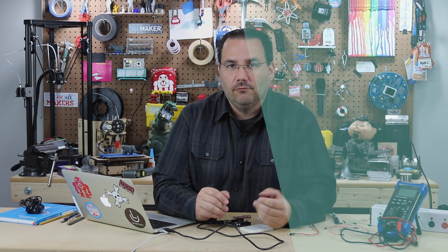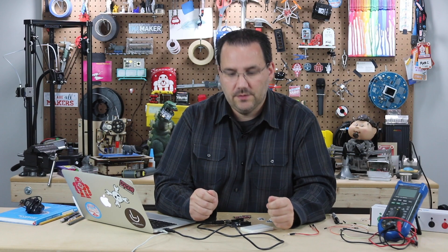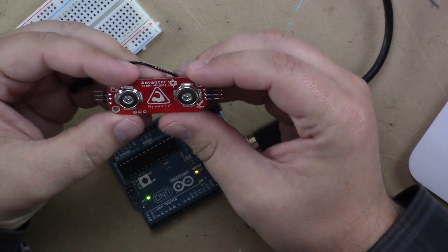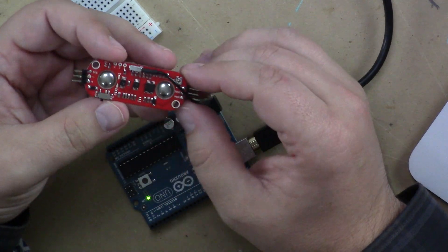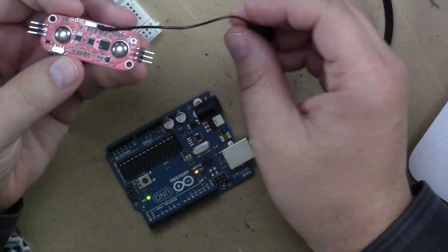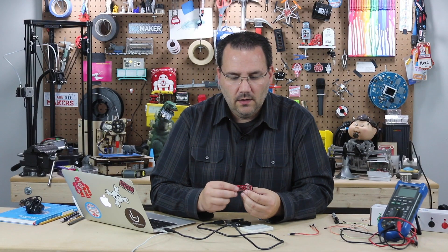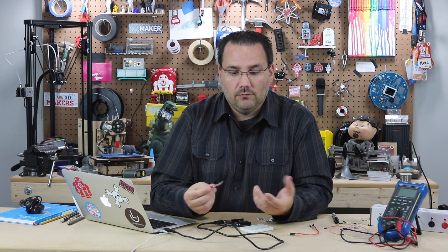Electromyography is typically reserved for really expensive biomedical devices, but believe it or not, you can do it with an Arduino and this handy little breakout board from Advancer Technologies called the Myoware. You can see I've soldered a few header pins on here already for another project. Today we're going to test it out and look at what analog voltages come out of it. If you can get an analog voltage from 0 to 5 volts, you could map that to a servo to turn from 0 to 180 degrees and create your own robotic arm, or really anything you want.